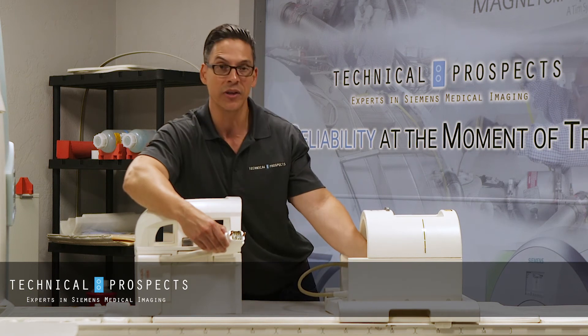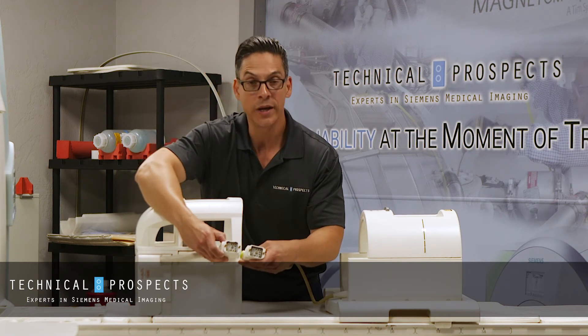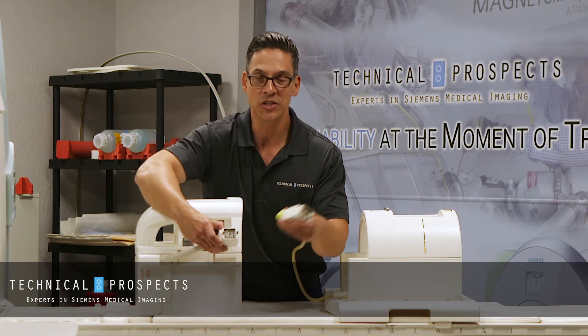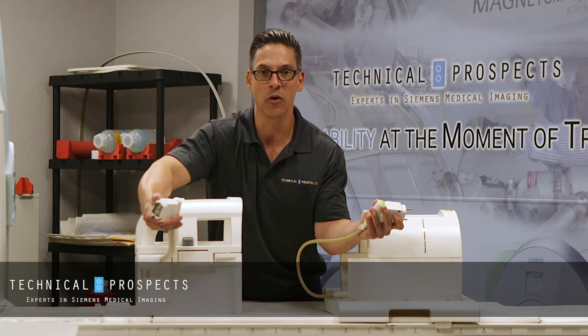I'll show you both again side by side. One has a copper plug in the middle and one does not. This one's a transmit receive coil; this one's receive only.